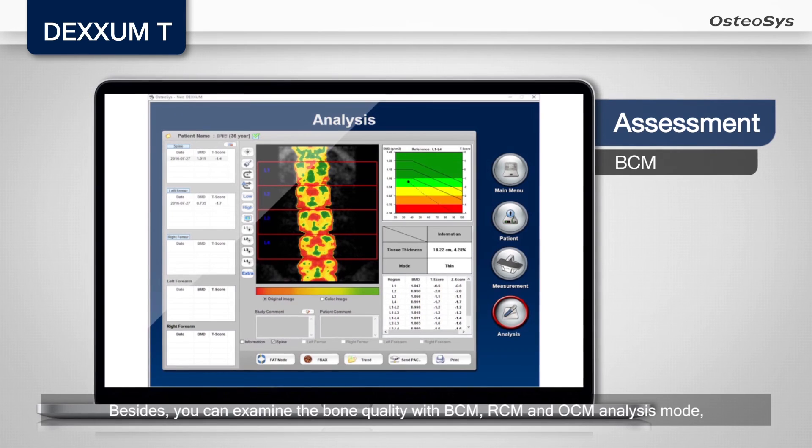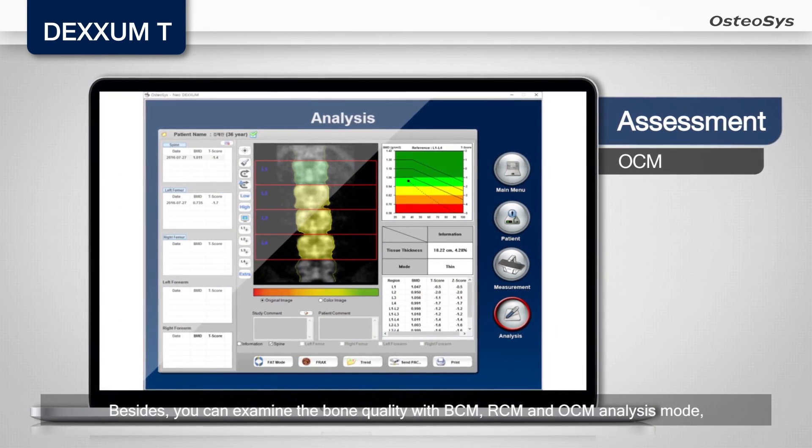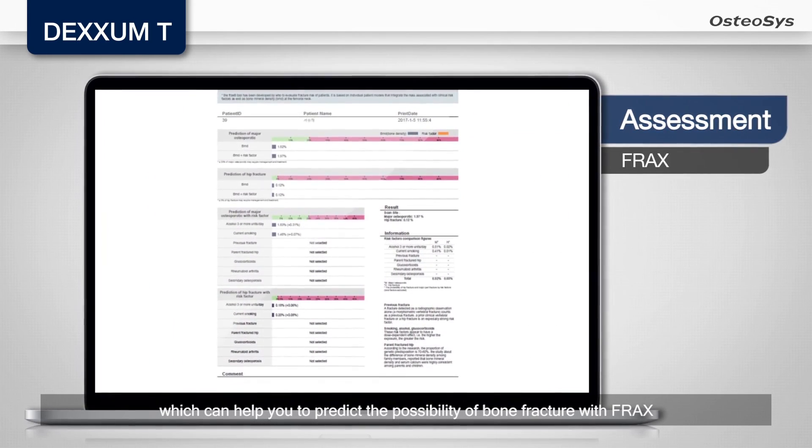Besides, you can assess bone quality with BCM, RCM, and OCM analysis modes, which can help you predict the possibility of bone fracture with FRAX.